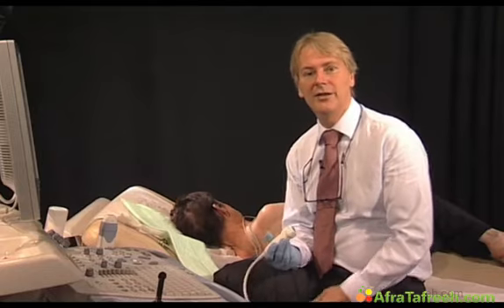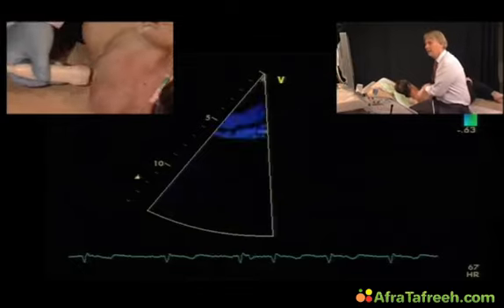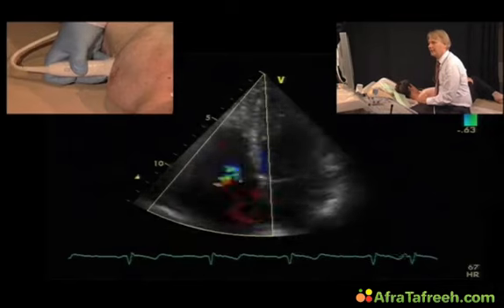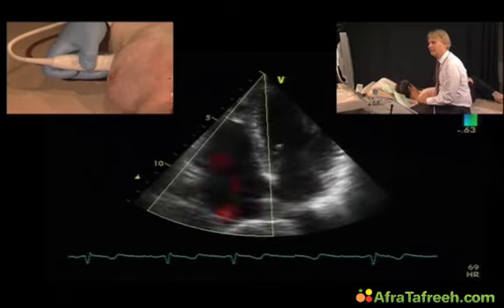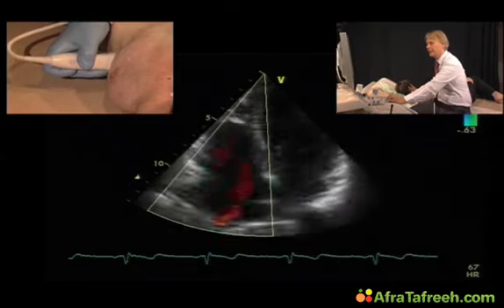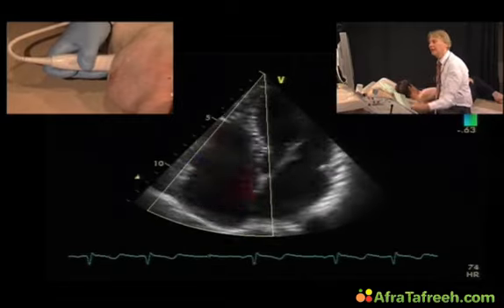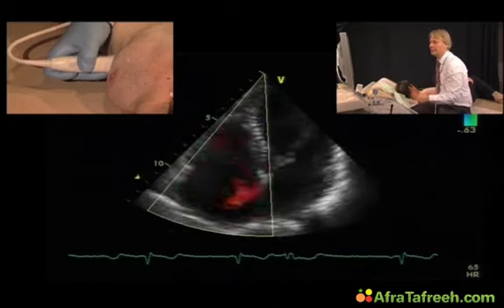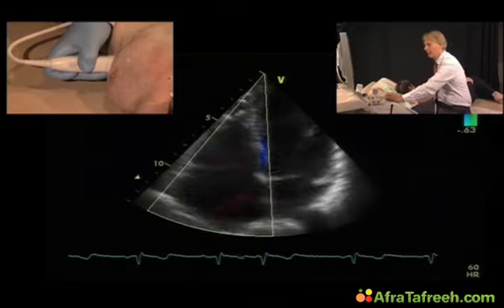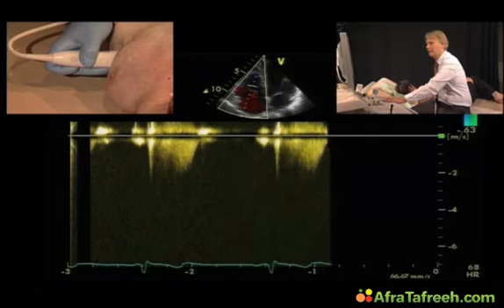This is a situation where it's very problematic to actually quantify pulmonary hypertension or pulmonary pressure because, as you will see, the regurgitant jet is very complex and eccentric. The patient has prolapse of the tricuspid valve, and we see that the jet probably moves out of the imaging plane, either towards the front or towards the back, so we cannot really see in which direction the jet is going. We can see the origin quite nicely, and I'll show you what happens if we put the continuous wave Doppler spectrum inside.